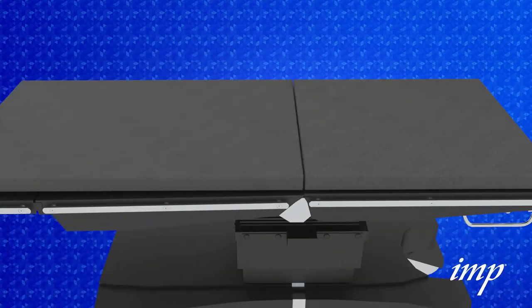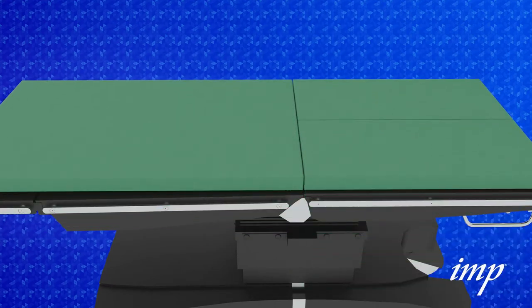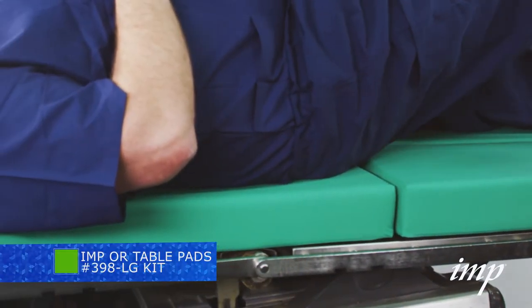To begin, replace the OR table pads with green IMP pads. Please note, it's not necessary to remove the X-ray cassette plates. Next, position the patient with the gluteal fold at the separation of the pads.